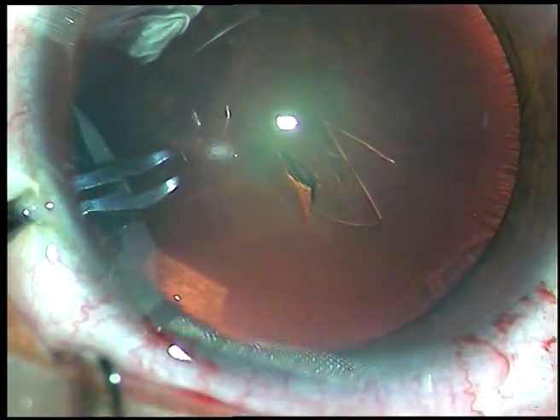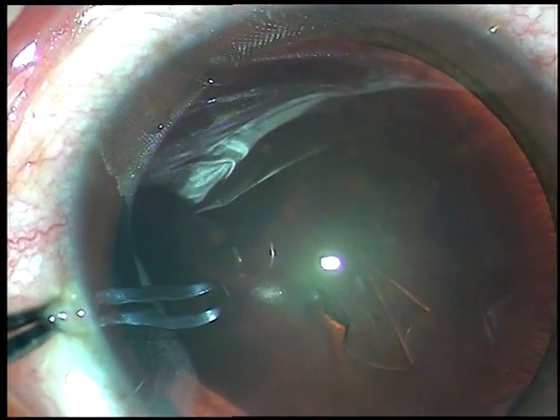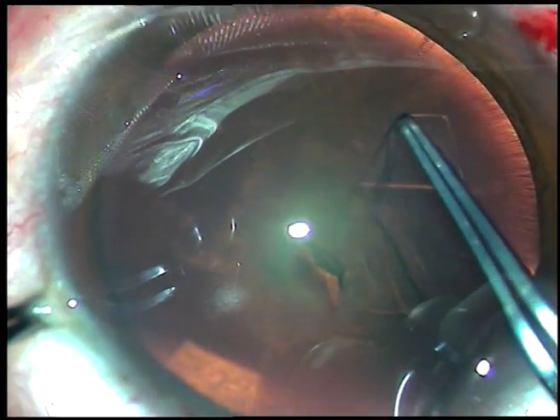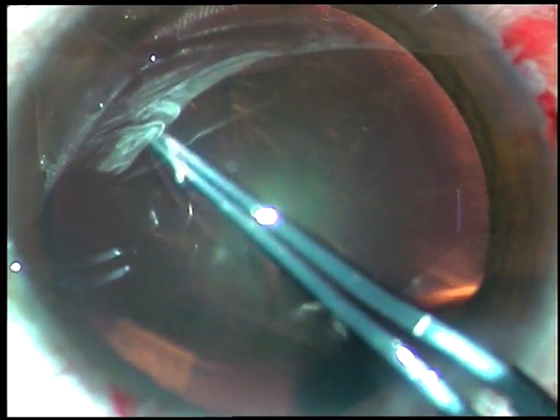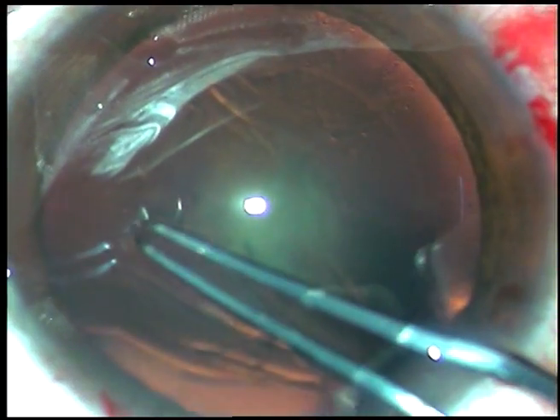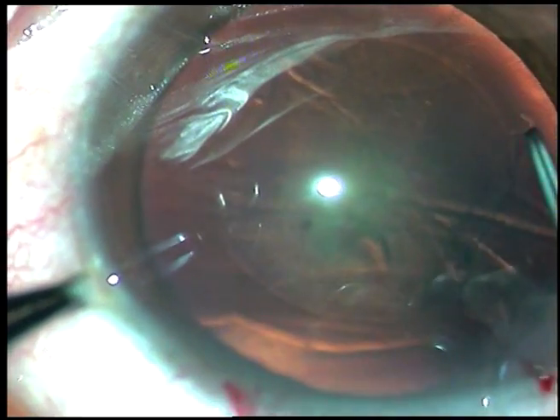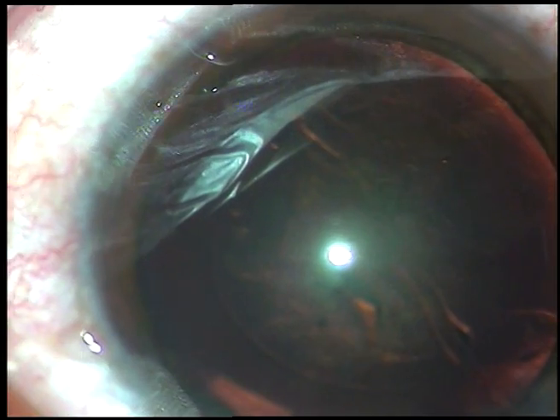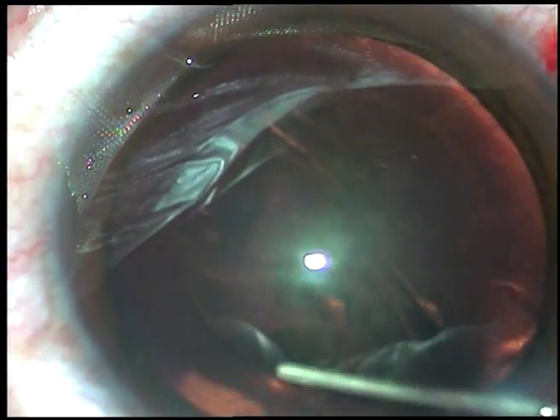This is the capsulorrhexis. I have incised the capsule and this capsular tag has been raised. I hold this tag with Utrata forceps. Going anticlockwise with just three grasps, I complete the rhexis. I try to remain at equal distance from the border of the pupil, and thus I manage to get a round rhexis.